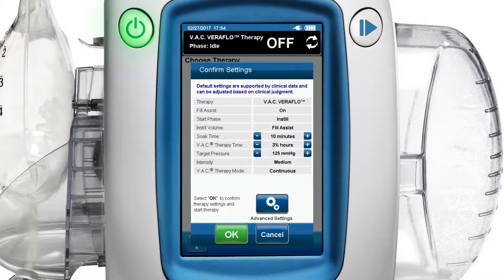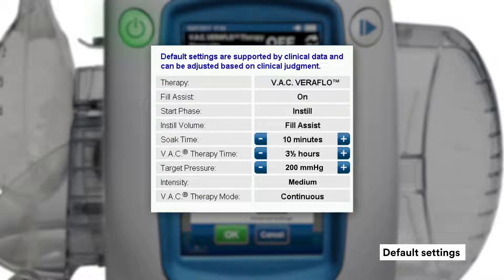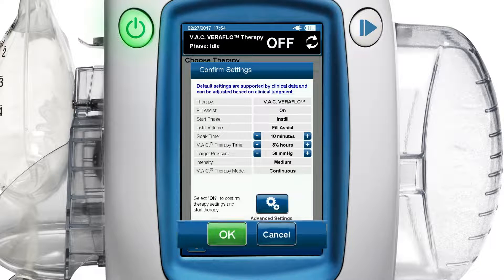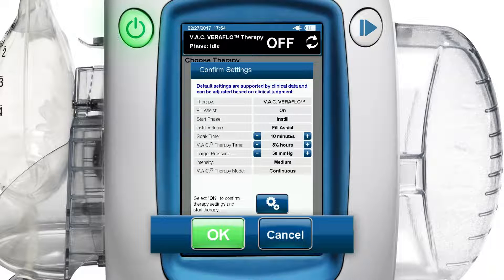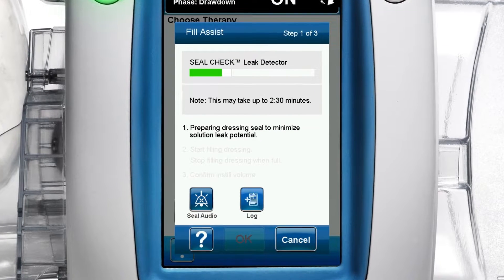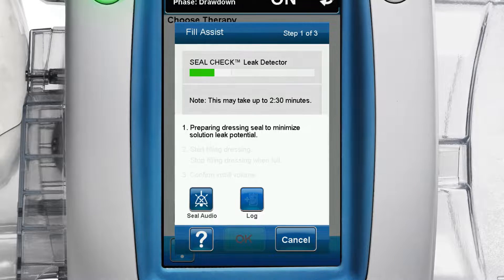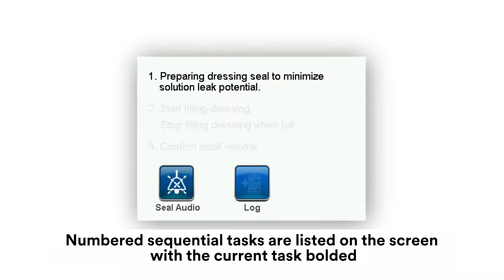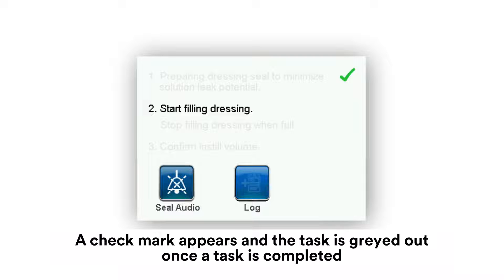Press the dark blue VAC VeriFlo therapy button. You can adjust the variables on the confirm settings screen using the plus or minus signs. Next, press the green OK button to accept settings and begin VeriFlo therapy. Now step one of three of the fill assist screen appears, drawing down the dressing to prepare the dressing seal to minimize solution leak potential. Numbered sequential tasks are listed on the screen with the current task bolded.